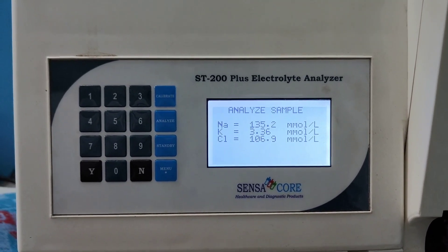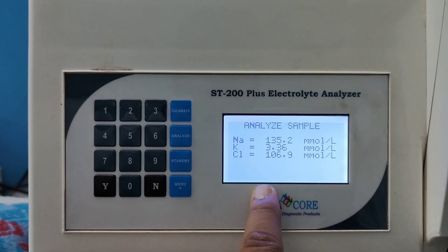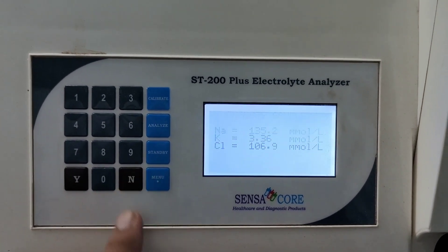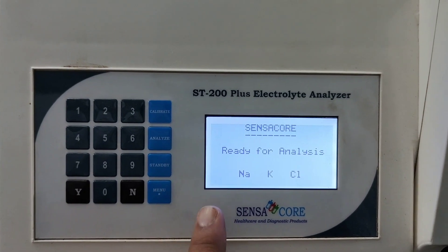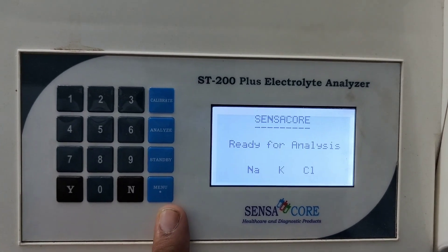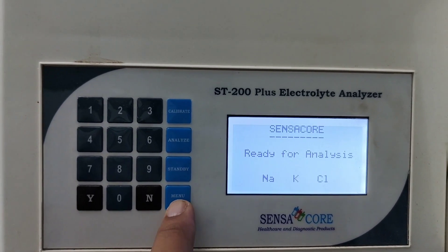After running the test and the value is given by the machine, you have to press NO — N for exit. Ready for analysis mode. This is the menu button. By using this button, we can perform various functions in this machine.